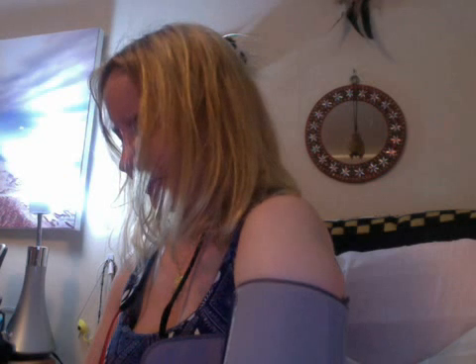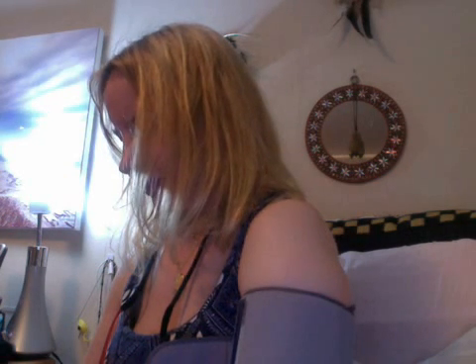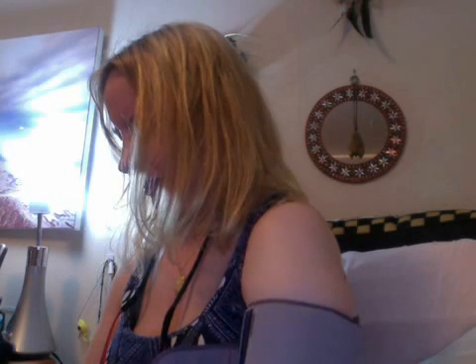Oh my god, my arm looks so fat in this! It takes a couple of minutes, and the results are 108 over 72 with a heart rate of 84 and a regular heartbeat.